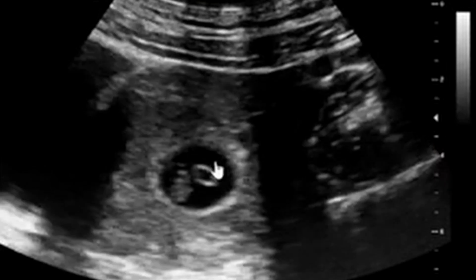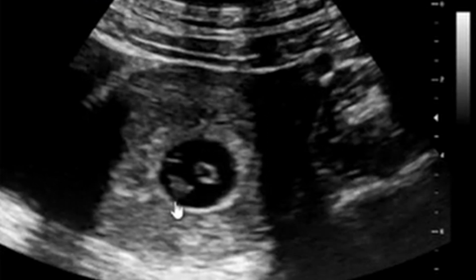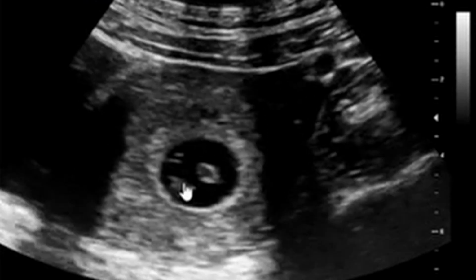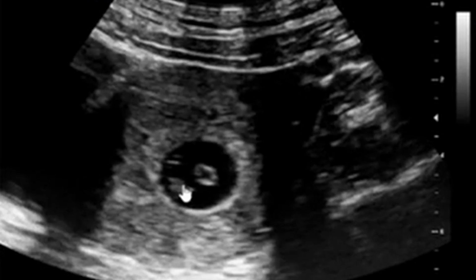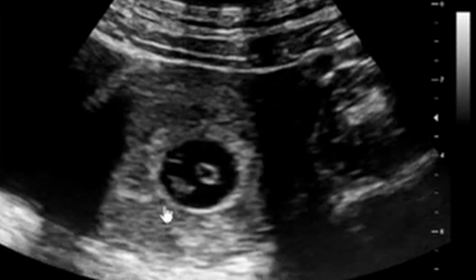Do not mistake a yolk sac with a twin pregnancy. If you look closely, you can see that there is a heartbeat here, around here. You can see that there's a heartbeat here, but the yolk sac, there's no heartbeat. It's a cystic space. It's vesicle-like. And then you can see there is free fluid in between here. So you can actually appreciate the distinction.